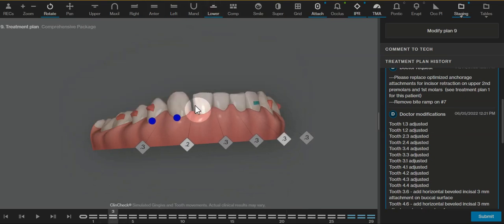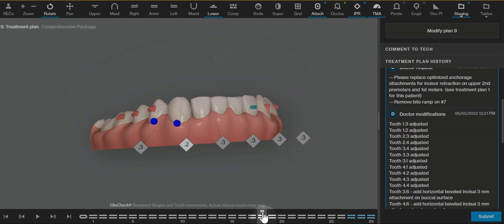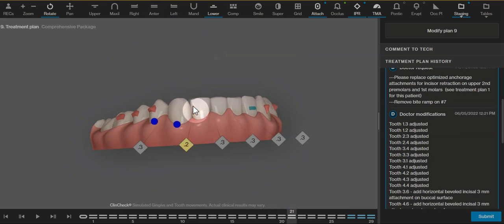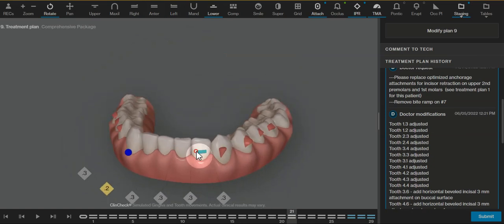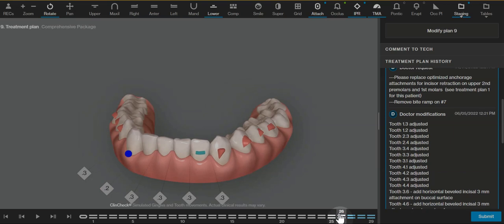In this area right here, you might find that you're doing fake IPR as well, like not performing the IPR. If these teeth are not in contact at aligner 21, then just mark it off on your sheet as if you did it and just move along through the treatment.